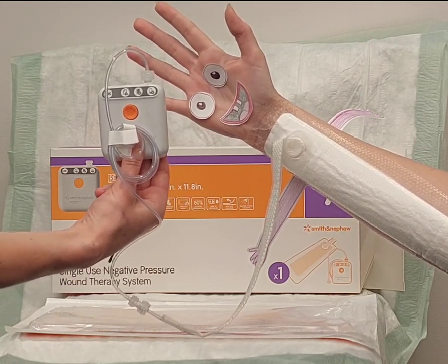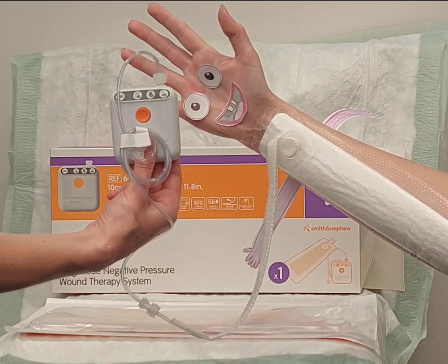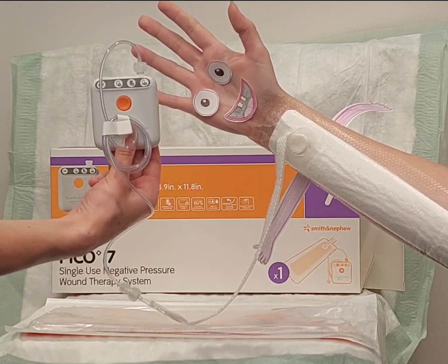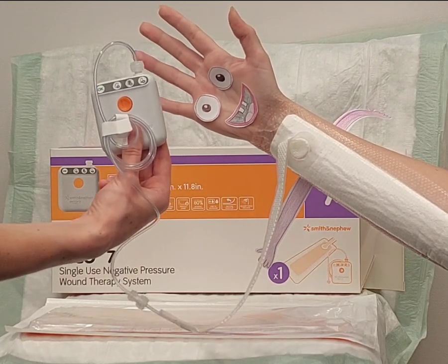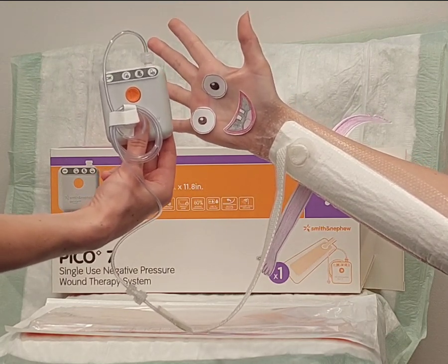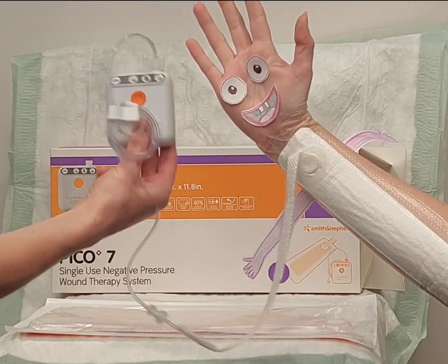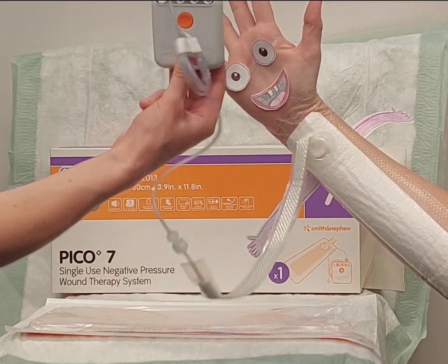If the third light is flashing, the batteries need changing. And if all of the lights are flashing, there is a problem with the pump and it may need to be changed. Finally, if no lights are flashing, the pump has reached the end of the 7-day lifespan and the pump and the dressing need to be changed or removed.